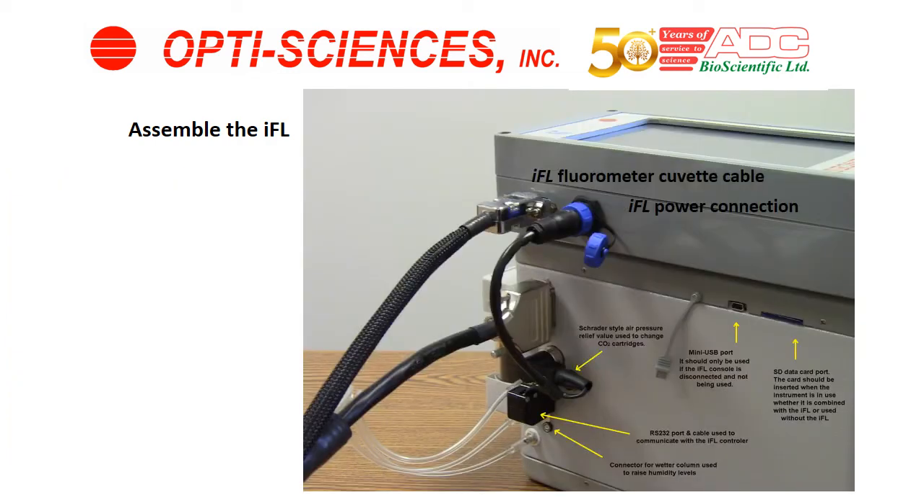Next, turn the instrument over and make sure the measuring screen is facing upward. Connect the power cable that allows both consoles to share power and information. It's not possible to put them in the wrong place — they go in as shown. One component does cover the Schrader valve, and at the bottom there's a connector for the wetter column should you want to use it.